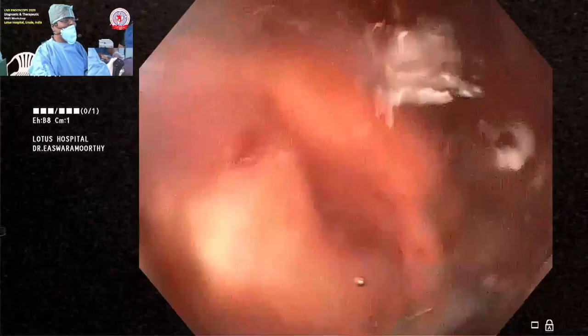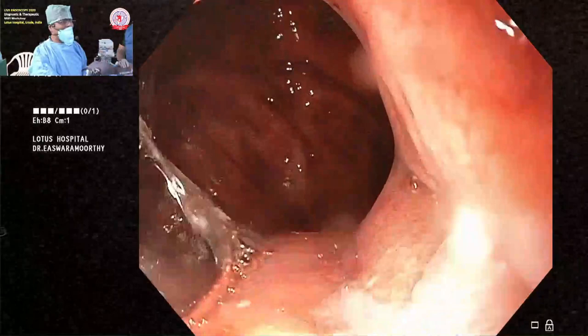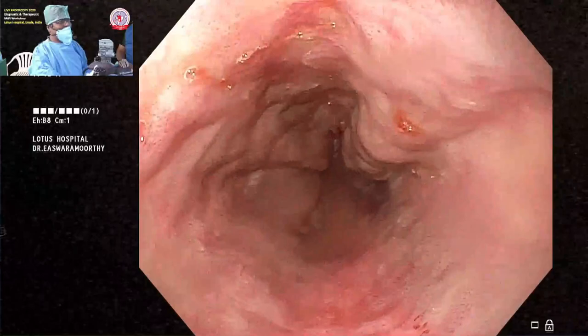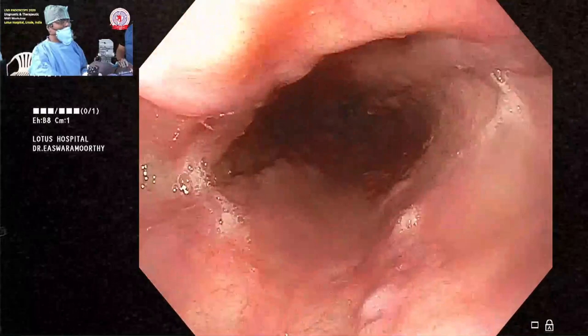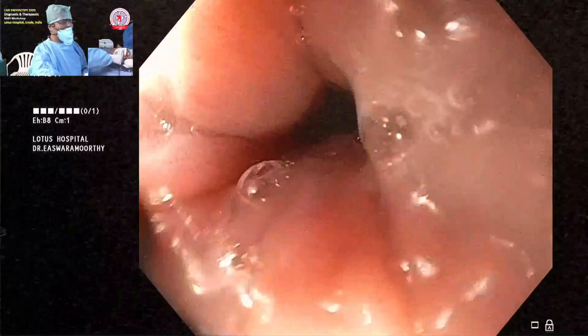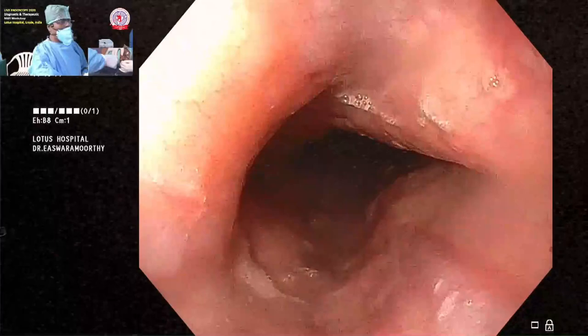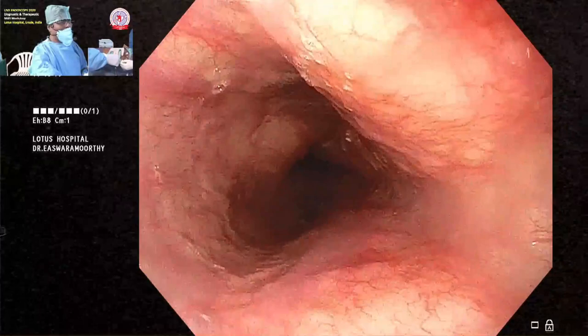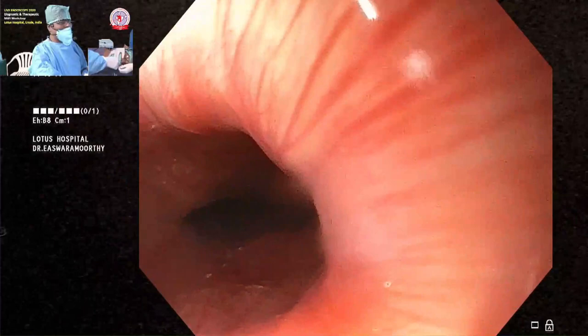Then perform the distensibility test: suction all the insufflated air and watch the rugal folds collapse in front of you. As you withdraw, similar to colonoscopy, take time during withdrawal — lesions can be seen on the way out. Be careful not to suction directly on varices; a 'sleeping tiger' can awaken and bleed. As I come out, note that my right hand is held right at the patient's mouth — this gives precise control of the shaft, millimeter by millimeter.